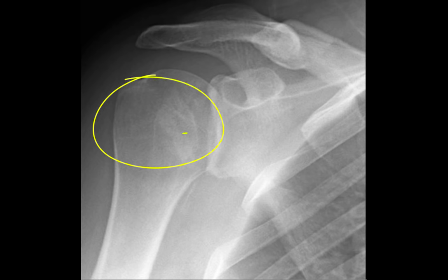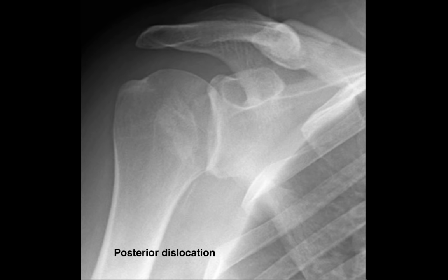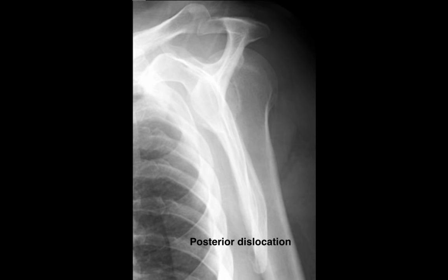Here we've got a humeral head that appears to be articulating with the glenoid fossa, however there's no space between the two. Apart from that, there's an abnormal symmetry to the humeral head — it looks more like a drumstick or a light bulb compared to a walking stick. This is a pathognomonic sign for a posterior dislocation, and that symmetry occurs because the humerus is rotated. Posterior dislocations are fairly rare, comprising less than 5% of all dislocations. They tend to occur with forced muscle contraction, such as might occur with an electrocution. We confirm the posterior dislocation by looking at our lateral Y view, where we can see the humeral head isn't overlying the Y intersection but is lying posterior to it.